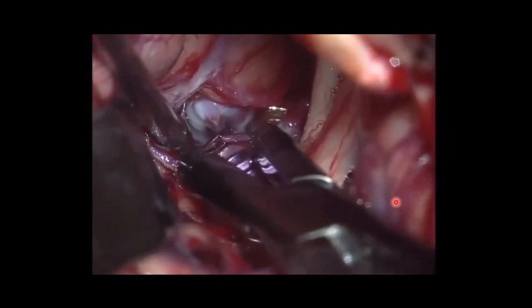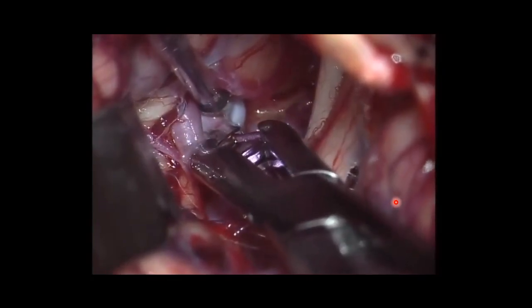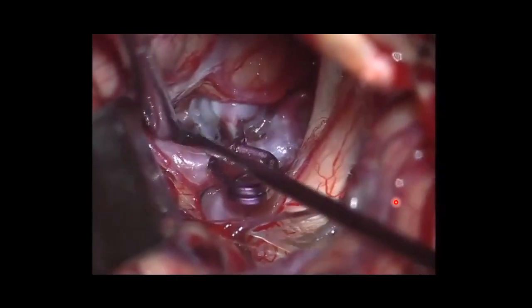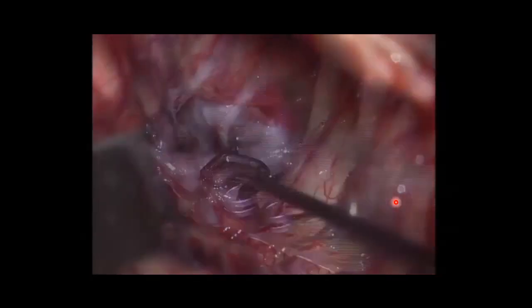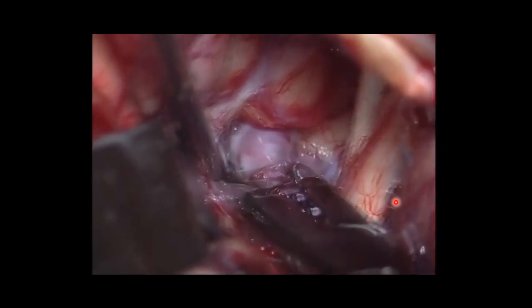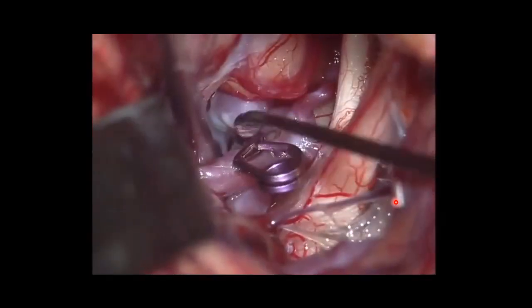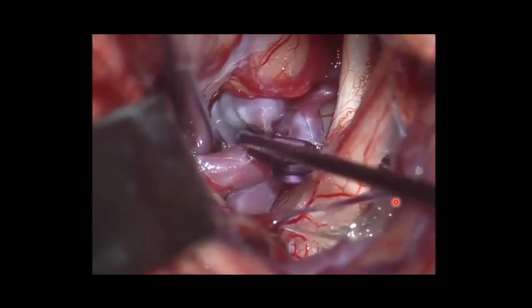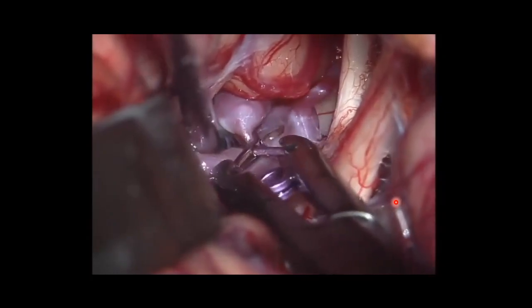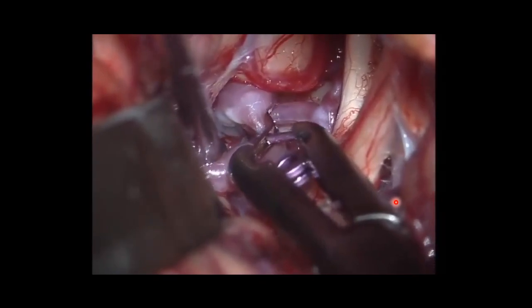Now he's checking, repositioning the clip, going deeper with the tip. Adjusting once again the clip. Now, probably part of the neck is still there. Adjusting again, trying to occlude completely the neck of the aneurysm.